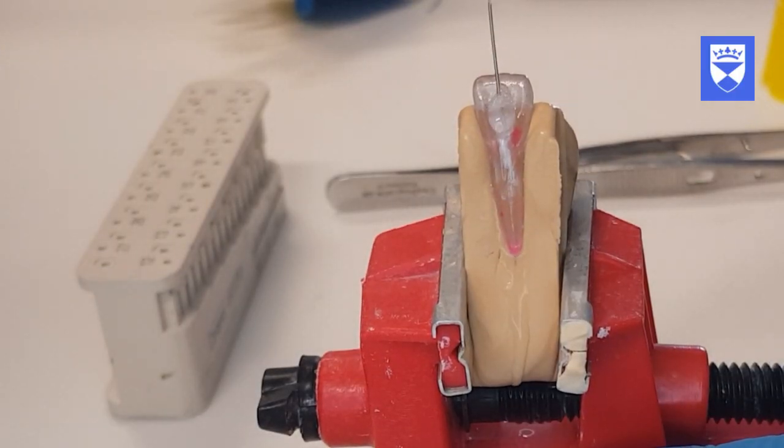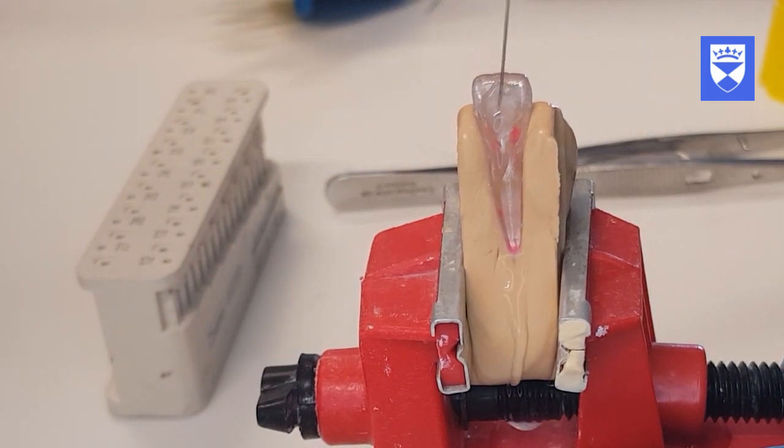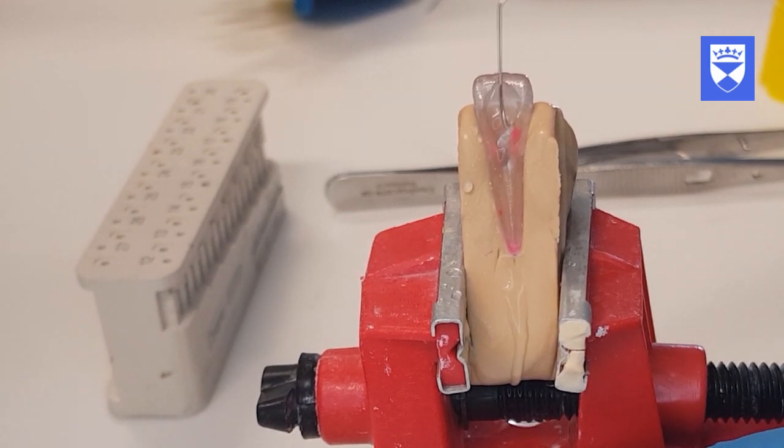To remove the calcium hydroxide paste, irrigate with 3 millilitres of citric acid followed by 3 millilitres of sodium hypochlorite. Do not dry the canal for the master cone fit.